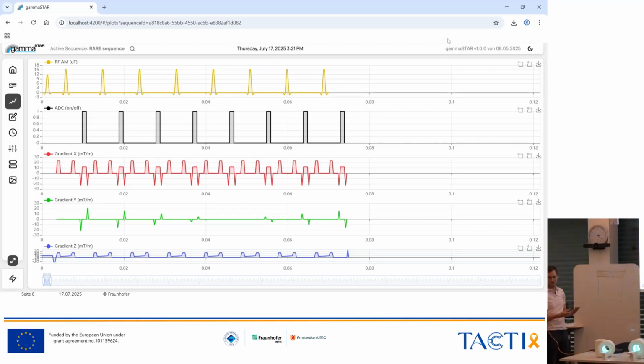We introduce a frequency in K-space, which would lead to ghosting in the spatial domain. In this case, it would lead to 6 or 8 ghosts overlapping the actual image.